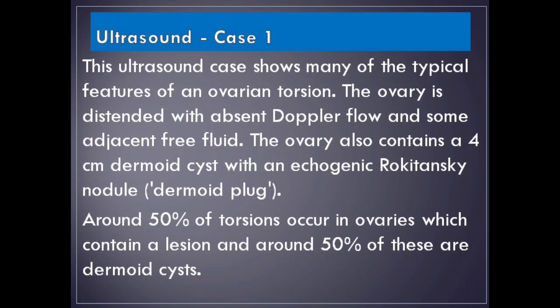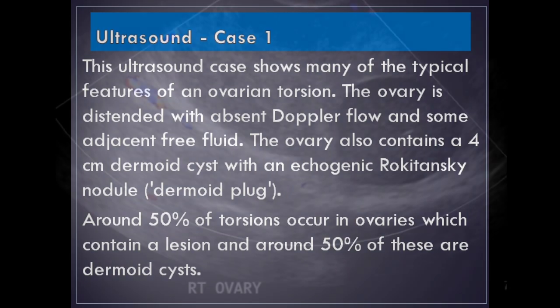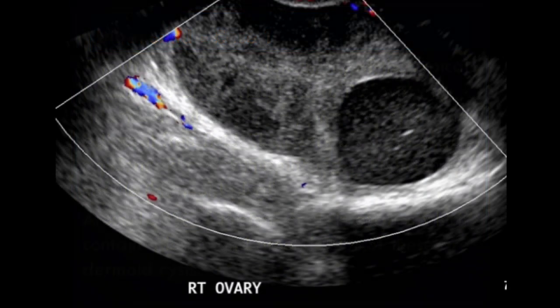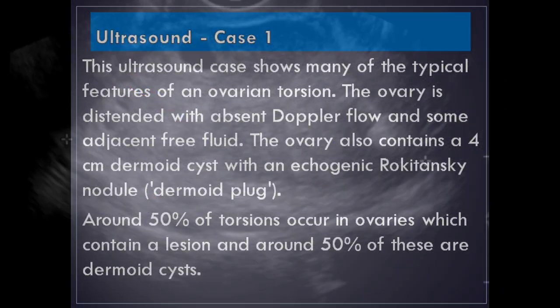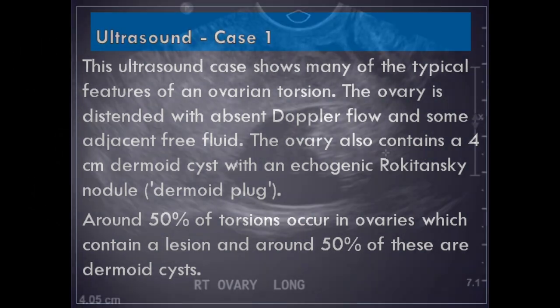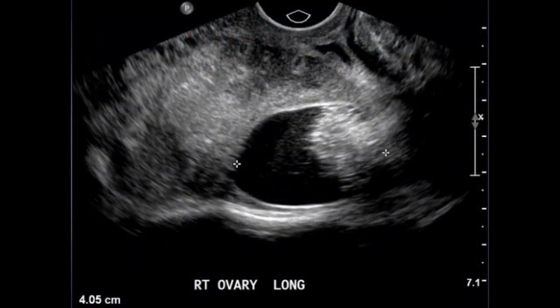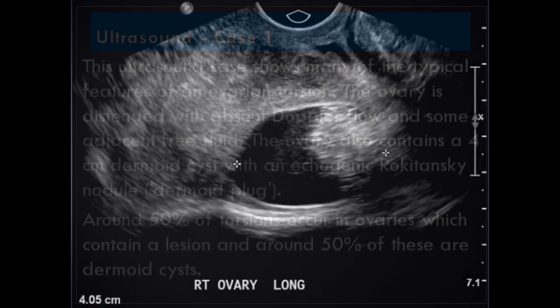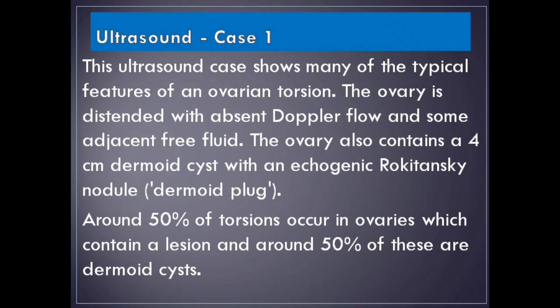Case 1: A 25-year-old female presented with severe lower abdominal pain. This ultrasound case shows many typical features of ovarian torsion. The ovary is distended with absent Doppler flow and adjacent free fluid. The ovary also contains a 4 cm dermoid cyst with an echogenic Rokitansky nodule (dermoid plug). Around 50% of torsions occur in ovaries containing a lesion, and around 50% of these are dermoid cysts.